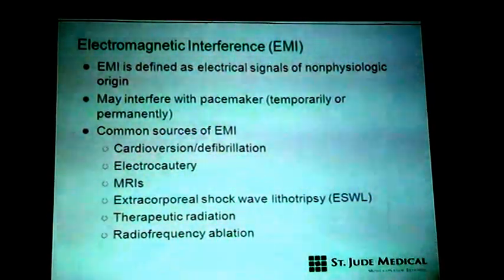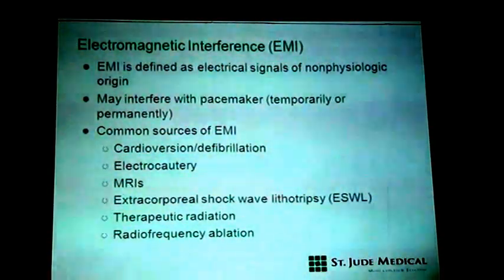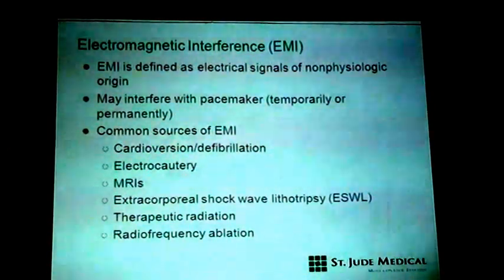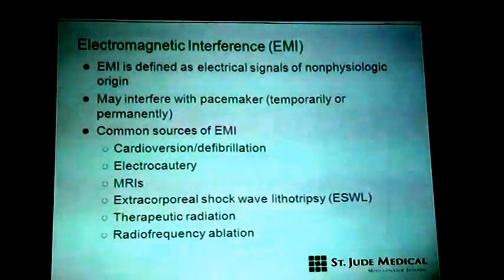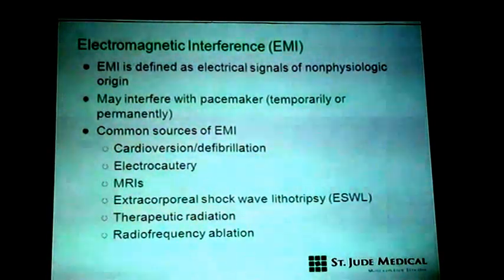These are the common sources of EMI for patients and the related doctors, and most commonly in practice, your mobile phone.